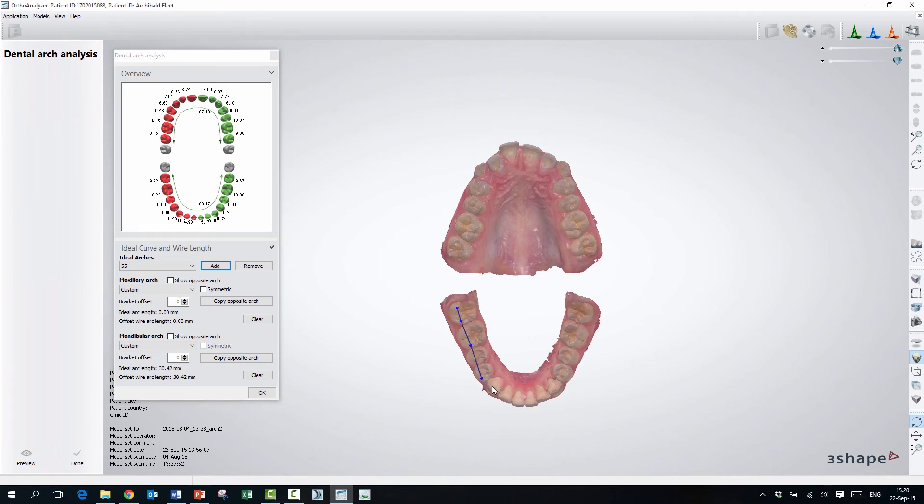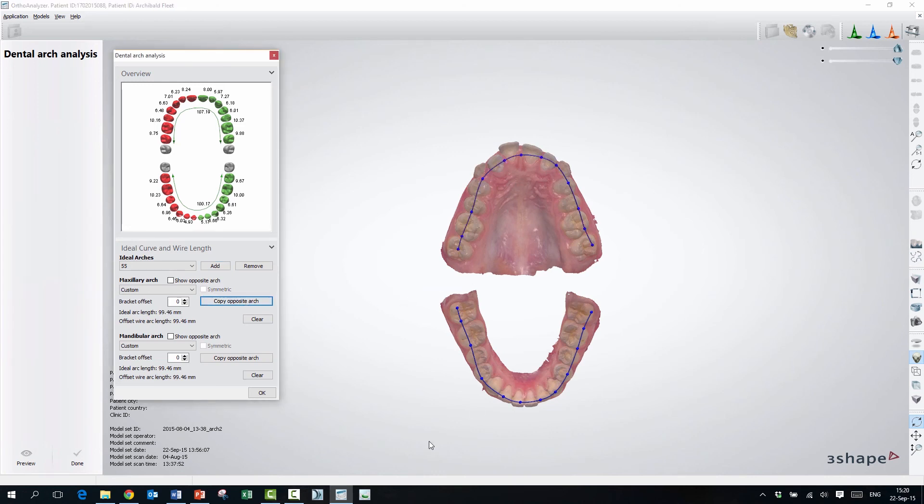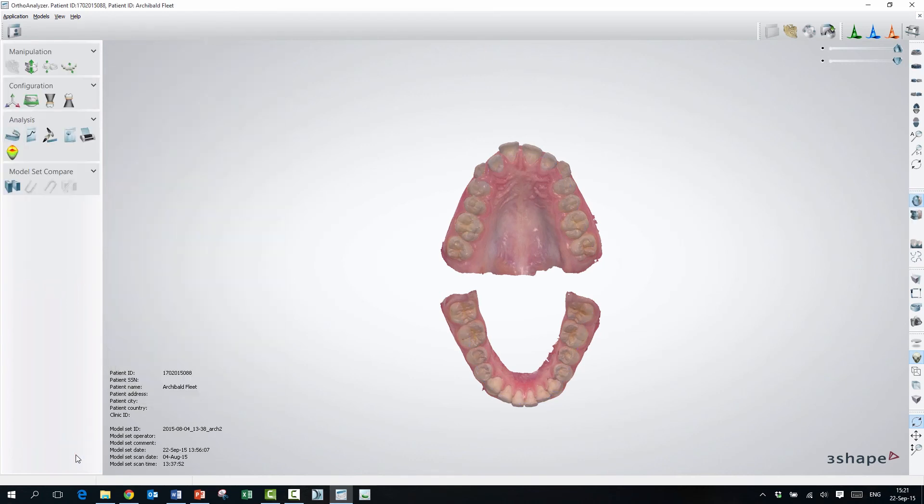So if I draw a line here, I'm going to use custom again and not symmetric. I can also use symmetric if I prefer, but now I'm just going to draw a line on the cuspids of these teeth. And I'm going to copy it to the other side like this. And now I'll save it. When I press Done, all the arches that I've made are going to be saved in the system.